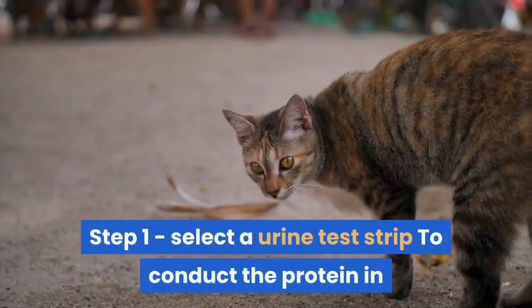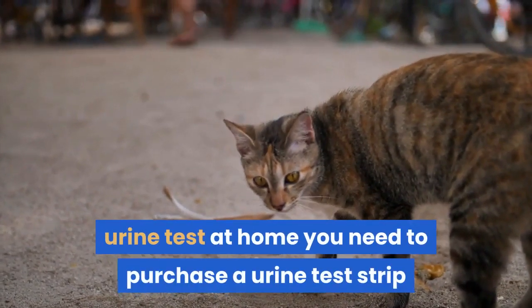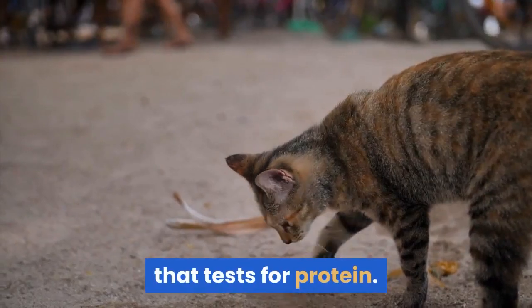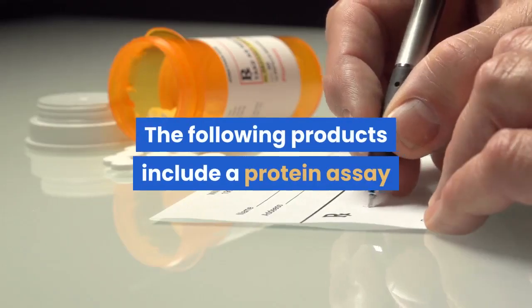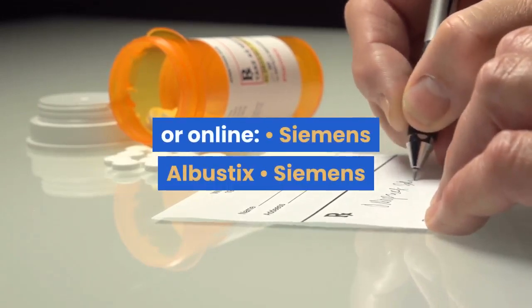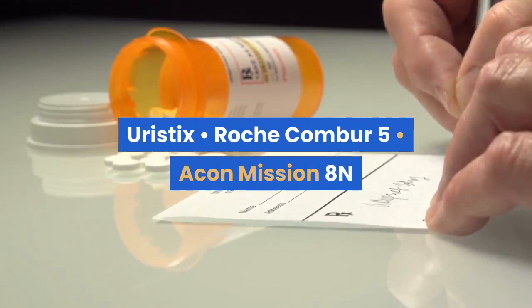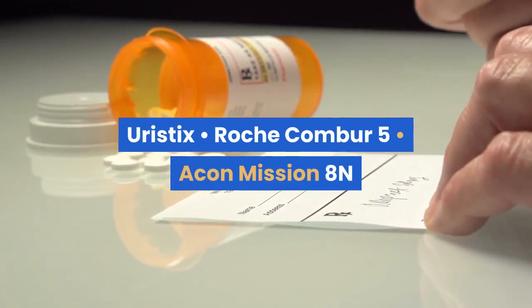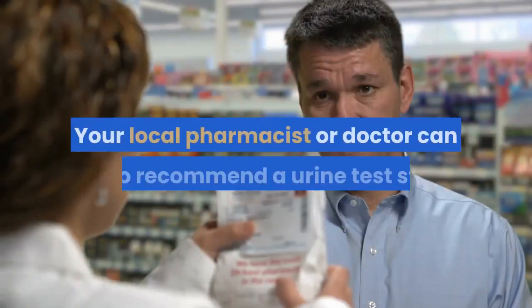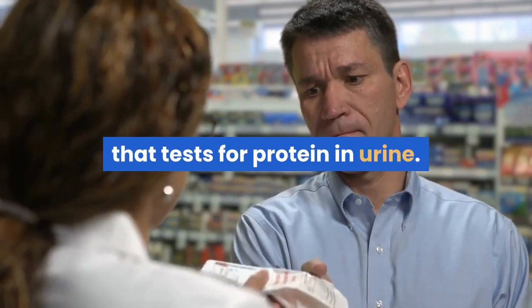Step 1: Select a urine test strip. To conduct the protein in urine test at home you need to purchase a urine test strip that tests for protein. The following products include a protein assay and can be bought inexpensively in a pharmacy or online: Siemens Albustix, Siemens Uristix, Roche Combur 5, Acon Mission 8N. Your local pharmacist or doctor can also recommend a suitable urine test strip.